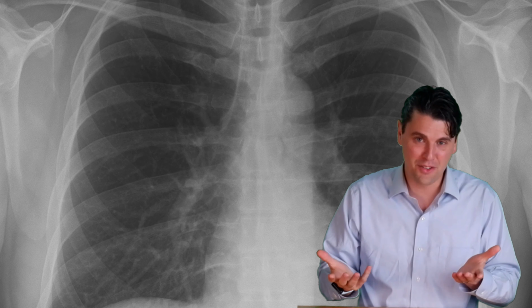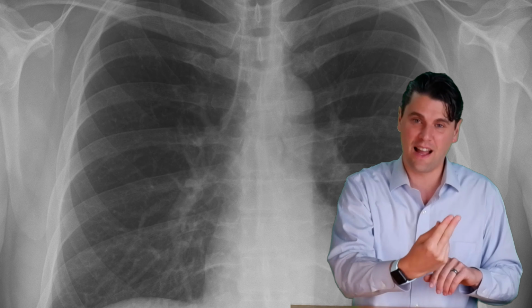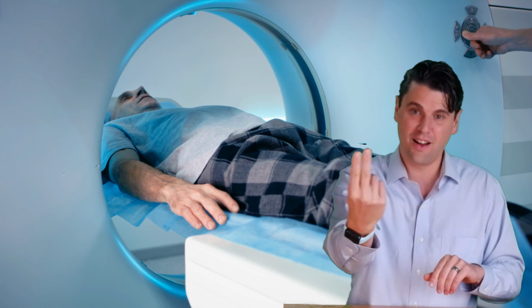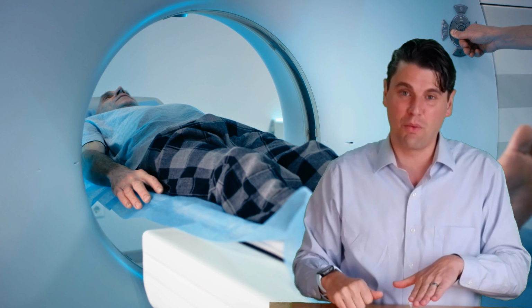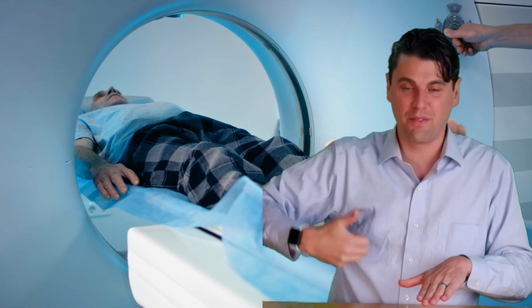When I was in middle school, I learned this shape was actually called a helix, where you're tracing out points on the surface of a cylinder and you're going up continuously. You're moving in what we call the Z direction, or the superior inferior direction of the patient, continuously. Some vendors call it spiral scanning, but the same idea.